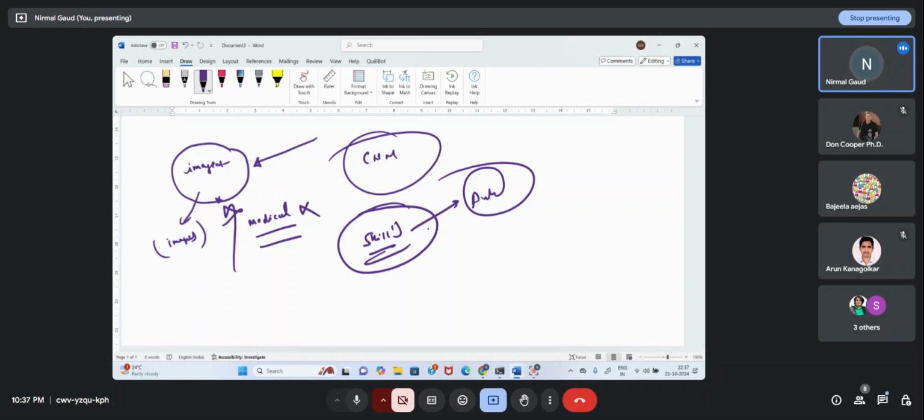practice. And I know that in this 1 hour I showed you a few points where I struggled, but literally I struggled a lot. You will not get this code anywhere. No one will try 6 to 7 architectures for any kind of result, and why and what happened. But with Xception, I got this result, and then I thought, okay, fine, done.